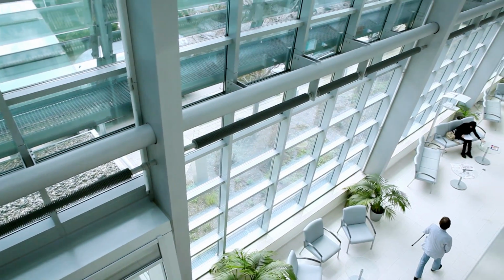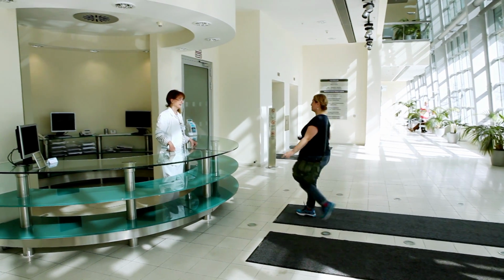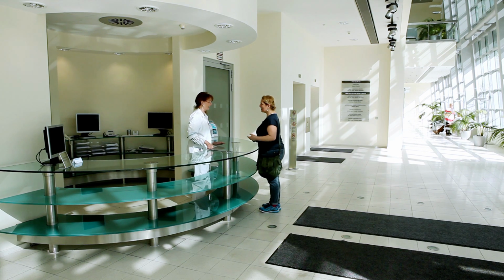We are treating here every tumor which is coming for treatment. This means we have no selection of tumors here. This especially concerns brain tumors, tumors in the lung, and head and neck tumors. This is most important with head and neck tumors because the salivary glands were mostly destroyed by conventional radiotherapy. The patients got a dry mouth, and for eating every day they had to drink a lot of water or have mixed food. With protons, the side effects are reduced to a minimum and the patients can eat normally during treatment. They have a normal food intake, they have no weight loss, and after the treatment they go home immediately. They need no rehabilitation at home, and their vitality is not at all influenced by the proton therapy.